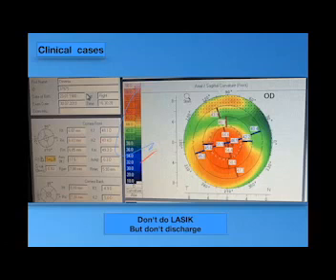What's your opinion in such a case? What will you think to do? It's open for sharing. Dr. Hossam? Yes. I will ask to check the other eye of the patient. And I will check clinically the best corrected visual acuity. And I will correlate the visual acuity of the patient with this topography.